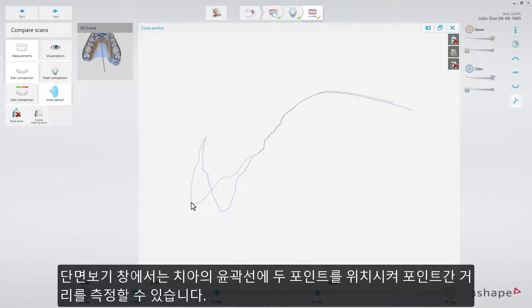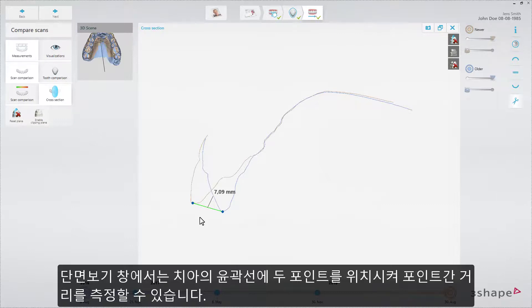Pressing on this window switches between these two views. To make a measurement, press on any two points on the cross-section's outlines and a green line will appear alongside a linear distance measurement.